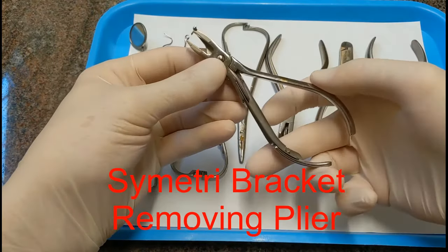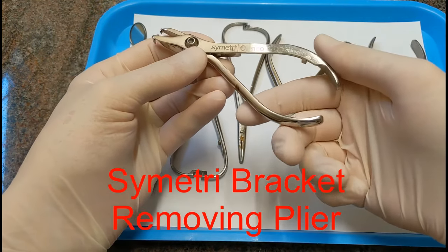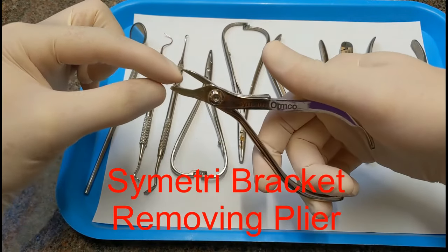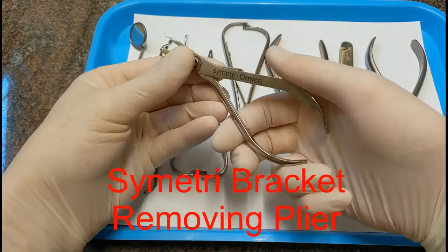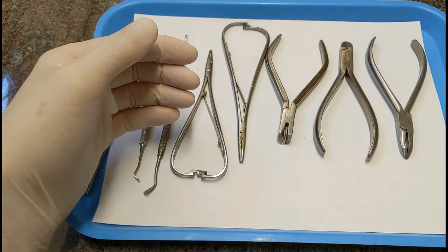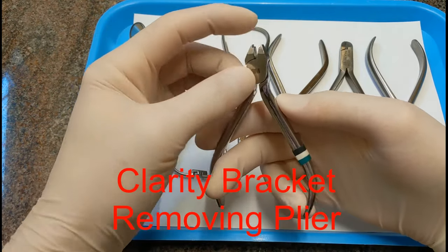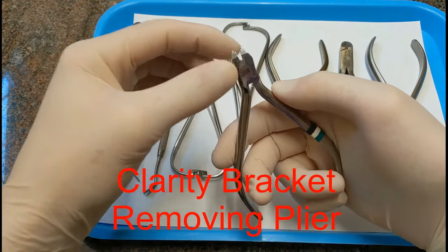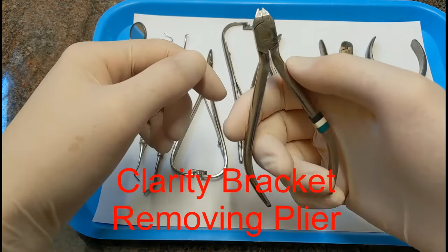This is also a bracket removing plier, but specifically for removing symmetry brackets — those are the symmetry brand porcelain brackets. It grabs onto the tie wings of the bracket, and when you squeeze, this little arm puts outward pressure on the bracket and pops it off the tooth. This is a clarity bracket removing plier — it's for removing clarity brand clear brackets. You get hold of the bracket, squeeze, and it breaks them and pops them loose.